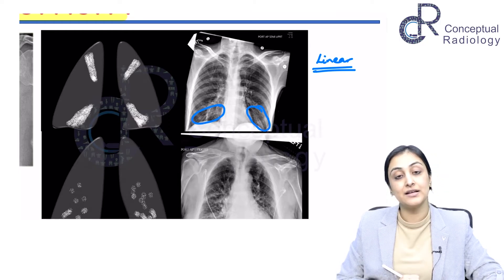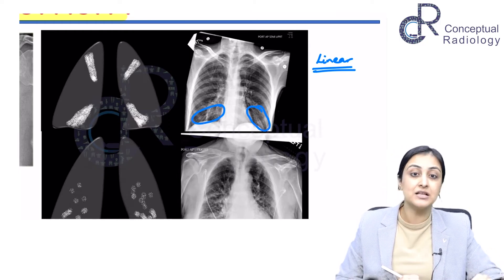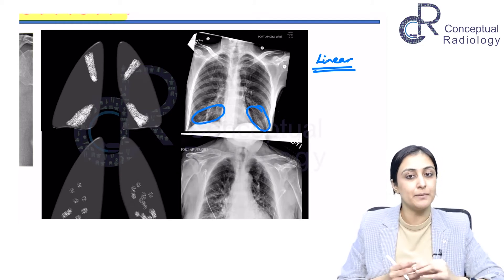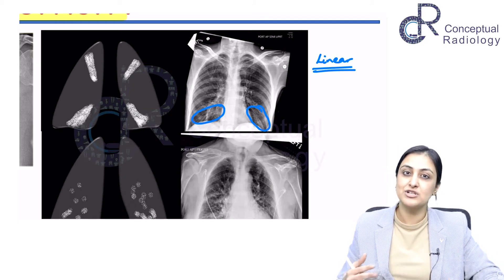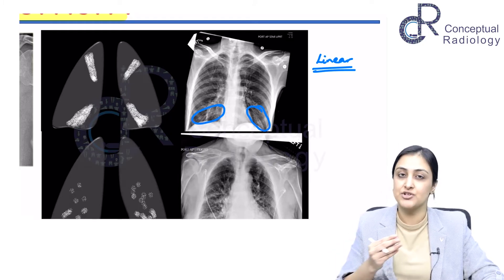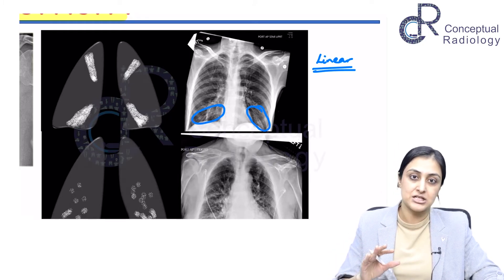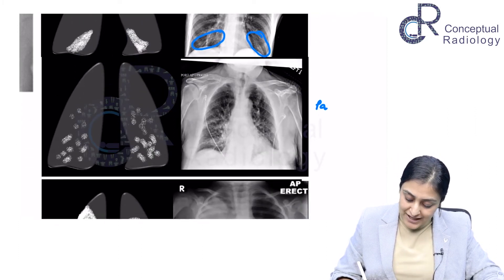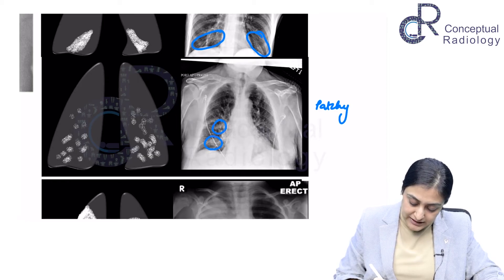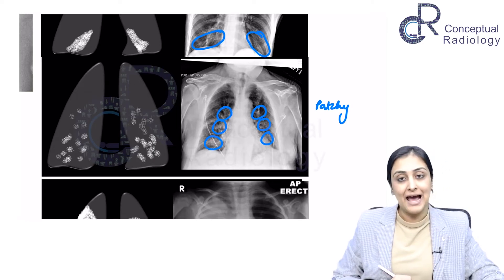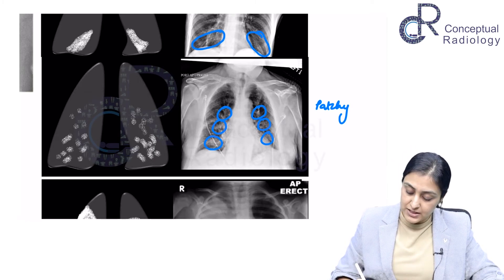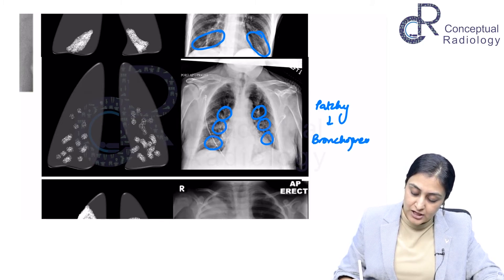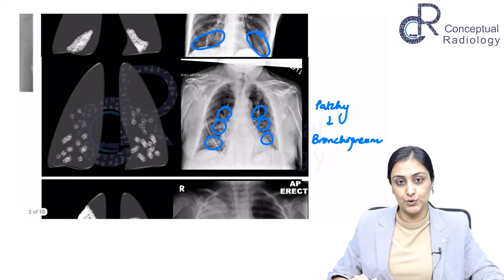These linear airspace opacities could be basal atelectases or basal consolidation, which is present mostly in smokers and elderly patients. Then when we look here, these are our patchy opacities — you can see multifocal opacities in the schematic. These patchy alveolar airspace opacities are something you see very typically in a bronchopneumonia kind of setting, so you think in terms of bronchopneumonia.